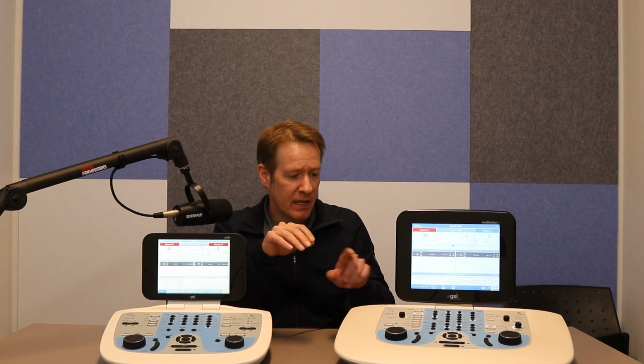One of the most popular ones is called time expire correct. And what time expire correct will do is it will basically allow you to then hit the interrupt button, it will play the first word, it will wait for a certain amount of time, and there's a little counter on the word nav that will allow you to select how many seconds you want. I would suggest 1 or 2, because if you put it up to say like 4 or 5 seconds, it will really feel like a long time between the different presentations. So we make our adjustment there.